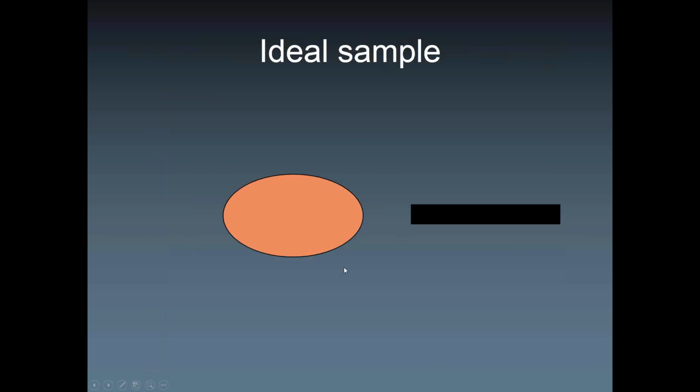Okay, so what does the ideal sample look like? This is a basically a stylized sample. It's just an oval thing, and this is our simplified introducer. The side notch biopsy device goes in there. Then you fire, deploy, and you can deploy into the middle of the target if it's a small one, for example, and not safe to go through. But if you have a safe big target, you can fire through the whole lesion and get reference tissue from the distal part, from the lesion, and from the proximal part of the organ. You only need reference tissue of one piece on one side.